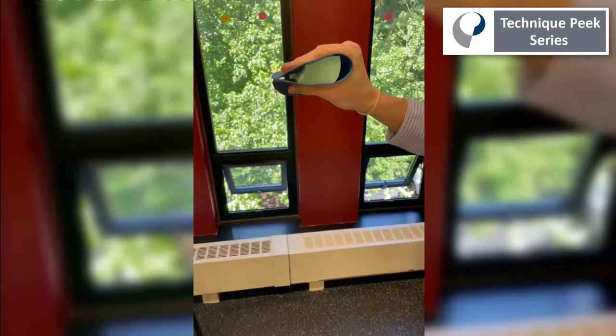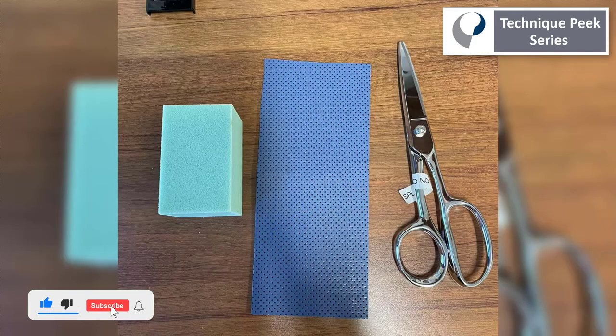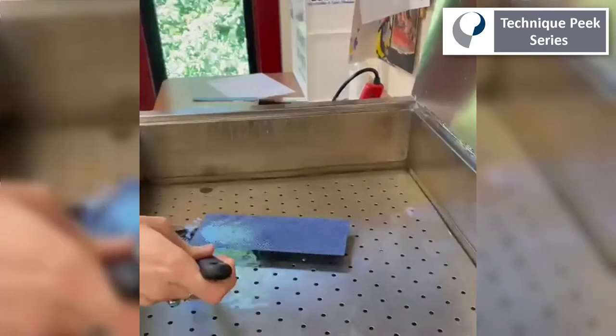Today we're going to show you how to make this great tool with some simple, quick and easy techniques to keep in your clinic. You're just going to need a piece of thin splinting material and a foam sponge.